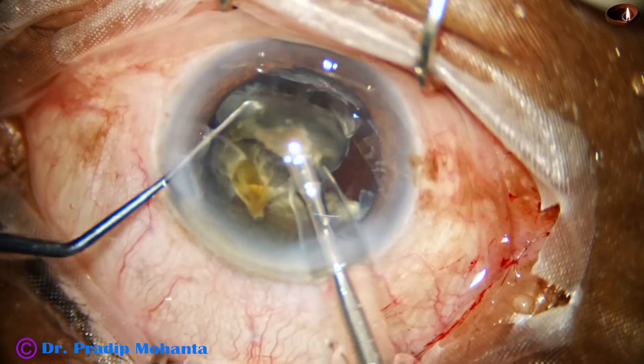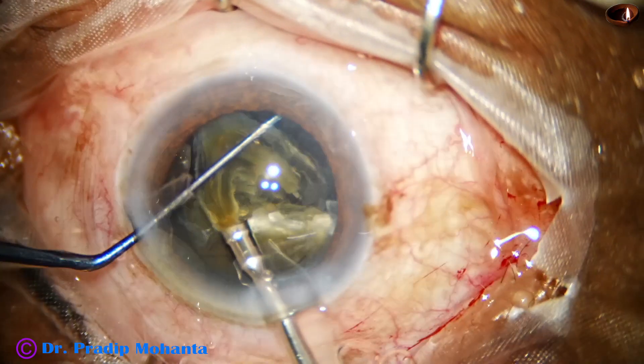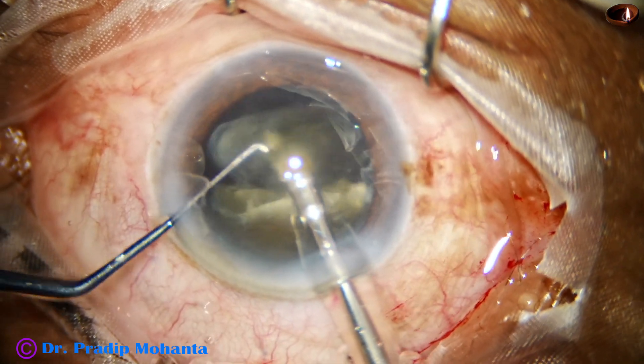Anyway, whenever it happens, we have to remove the air bubbles — we have to come to position 2, that is irrigation and aspiration, and then continue.